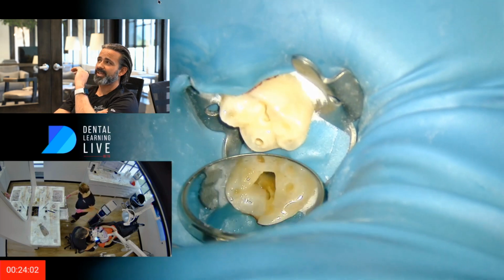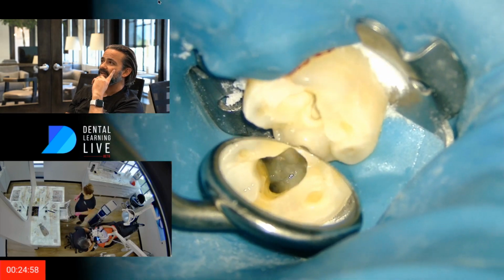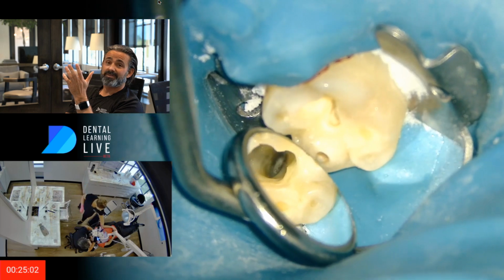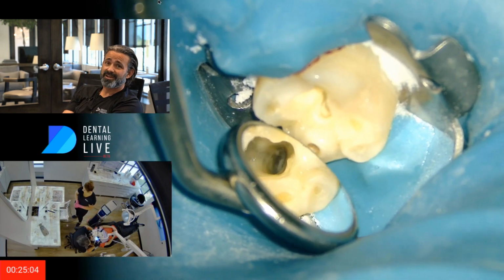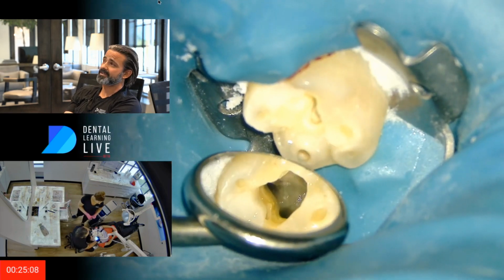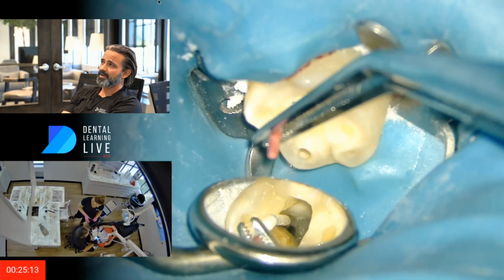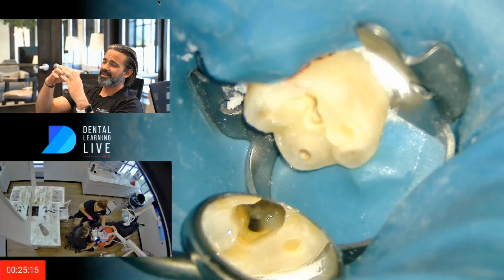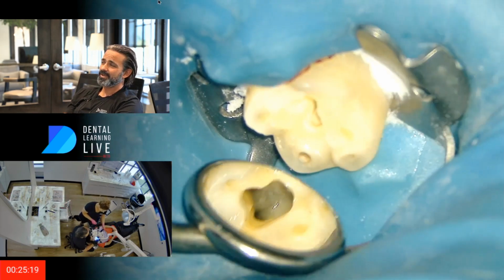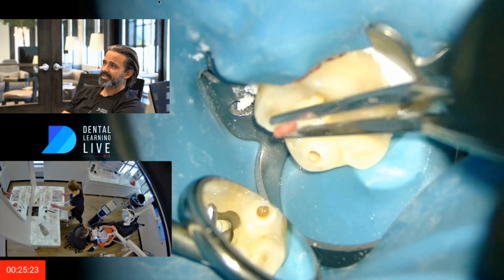There it is. So it looks like a little shadow right there. See if I focus in right there. So that, I didn't drill that out. I leaned up against it. I saw the discolored dentin. It's gone and clean, as well as the bacteria and the pulpal contents. So I'm going to put paper points in the ML first. You can see how that's kind of this new ovoid shape. I didn't instrument that shape. Now I'm going into the mesial buccal. And then watch this distal.